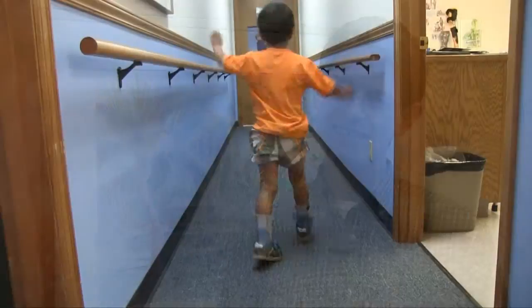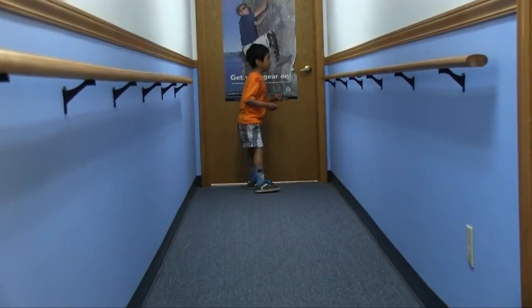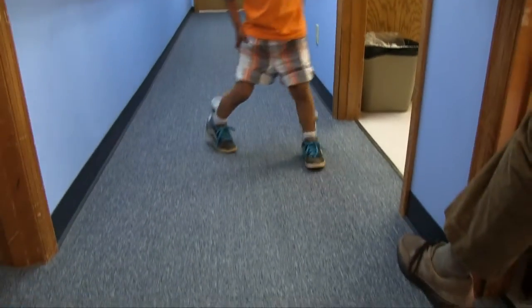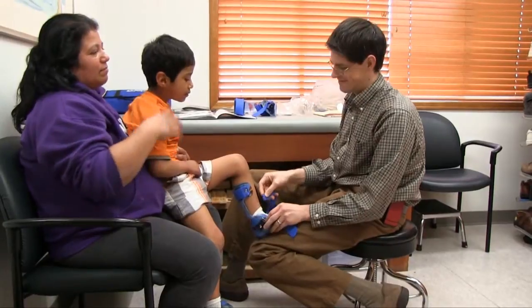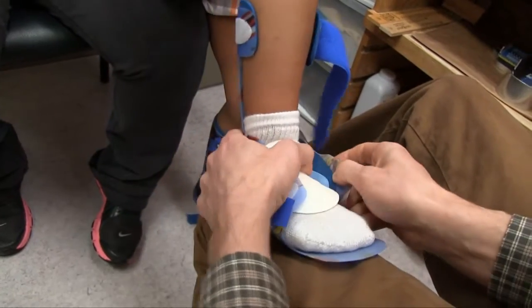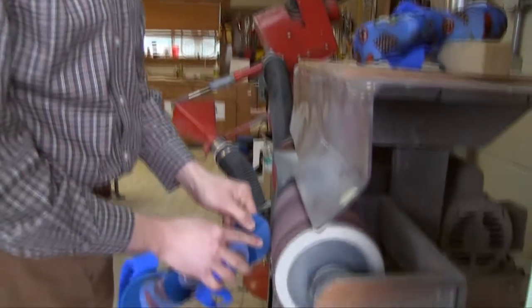So we decided, rather than doing a custom, let's start with a kangaroo and see if he would even tolerate keeping it on — which he did. He wore that for about six months, which brings us to about now. The therapist at school had put an anterior elastic strap on the front of the kangaroo to help provide a little bit of control to prevent the crouching. And he tolerated it, he left it on. So we thought, maybe we can go for a DAFO three and a half again and get the best of both worlds — instead of a firm block, because he's not hyperextending his knees as much, but he does have some foot drop. I think giving a little more plantar flexion flexibility with moderate resistance would be a smoother option for him.